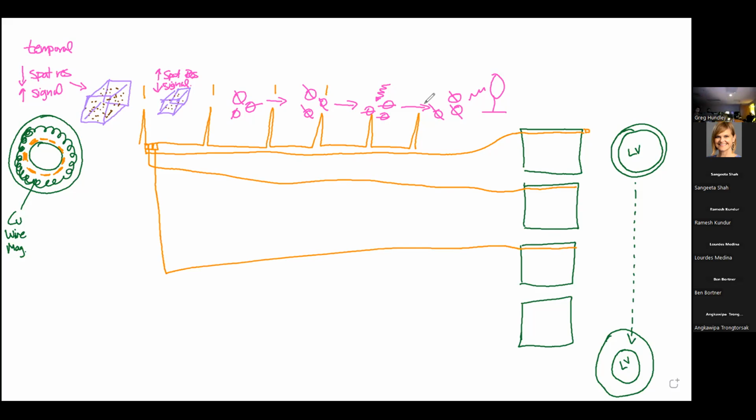Okay? Then what happens with the next QRS complex? Well, this moment of time, same as this moment of time over here, this comes over and populates this next line. And then this piece right here, this moment of time, comes over, does the next line. Everybody see how that works?